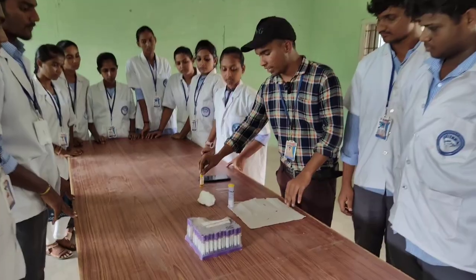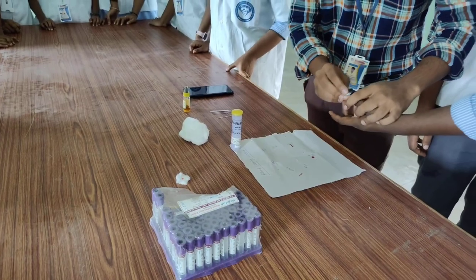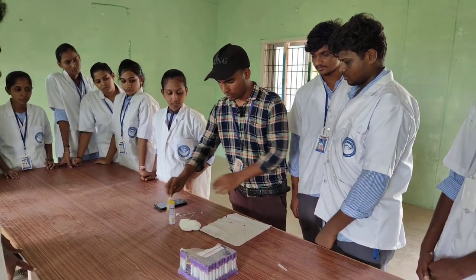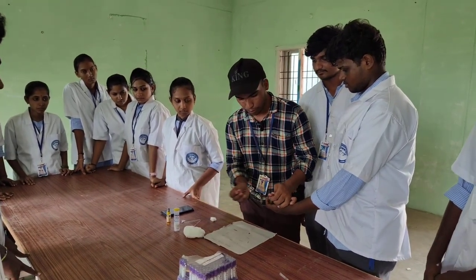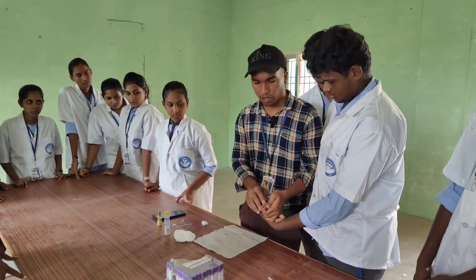First of all, take a surgical spirit and clean the finger with it. Then take a needle and prick the finger. Blood will start clotting.